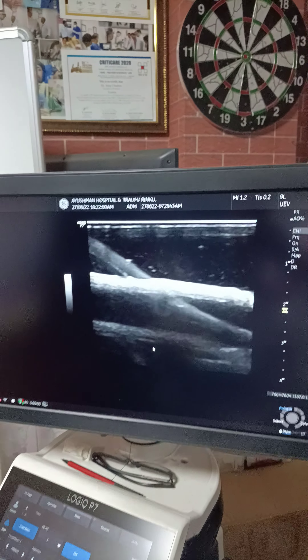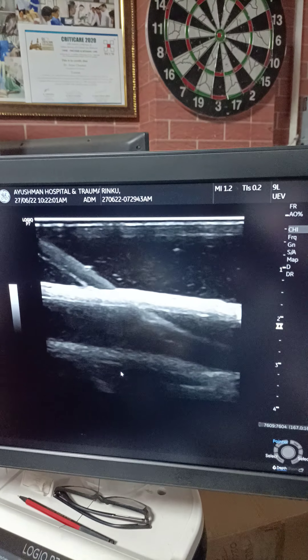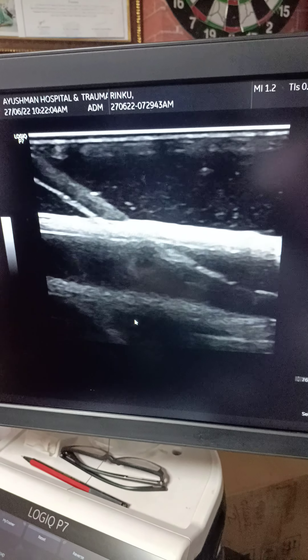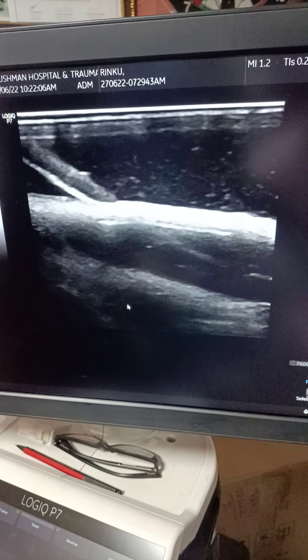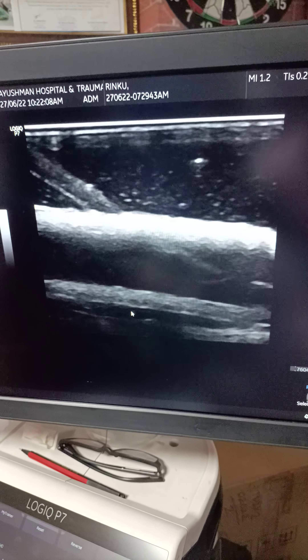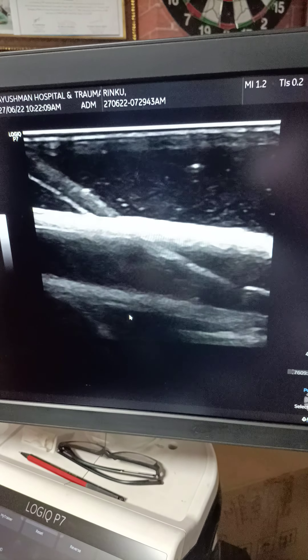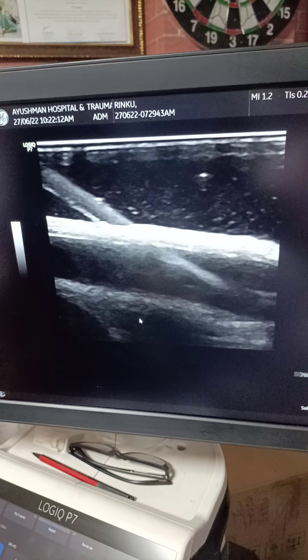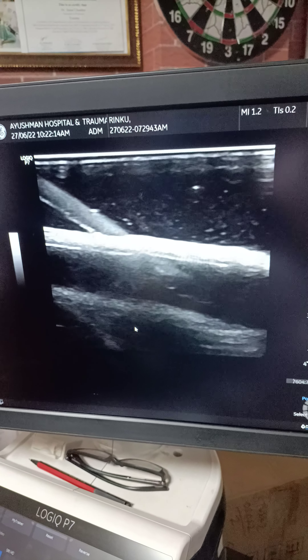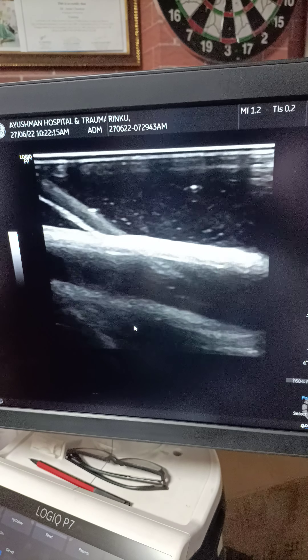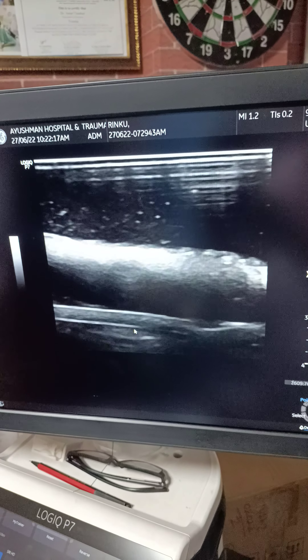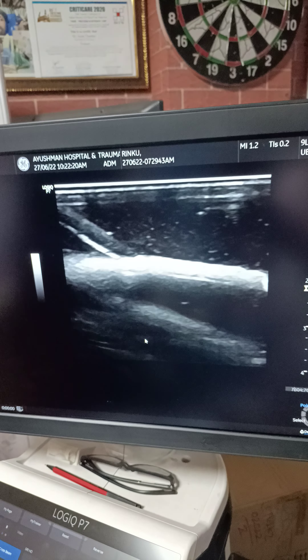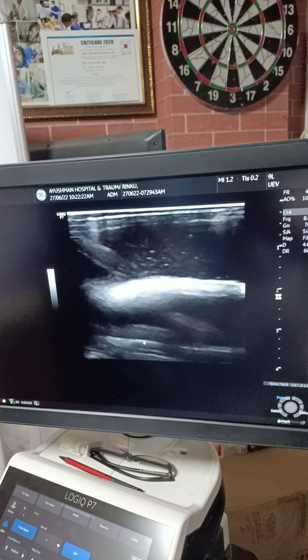This is our guide wire. The rest of the steps can be simulated to preserve the longer life of the mannequin, so here you demonstrate up to guide wire insertion — that's what we need to do, and after that it is straightforward. Now I will demonstrate the subclavian approach.